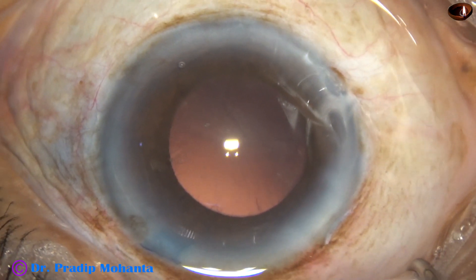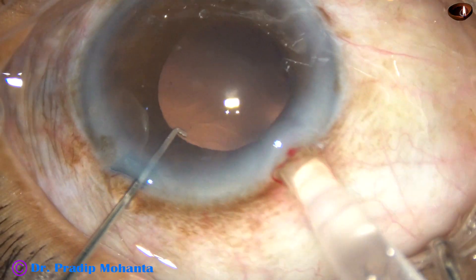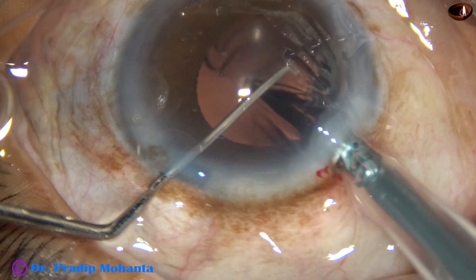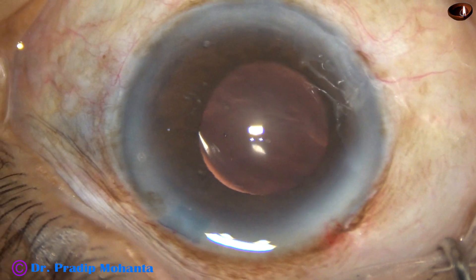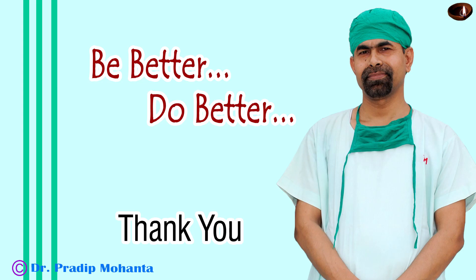After cortical clean-up, a monofocal intraocular lens is implanted in the capsular bag. After final cleaning, the case looks like this. Thank you very much for your attention. Hope this video will help you in developing your surgical skills. Be a great surgeon and serve your patients with love, respect, empathy, and great surgical competence.